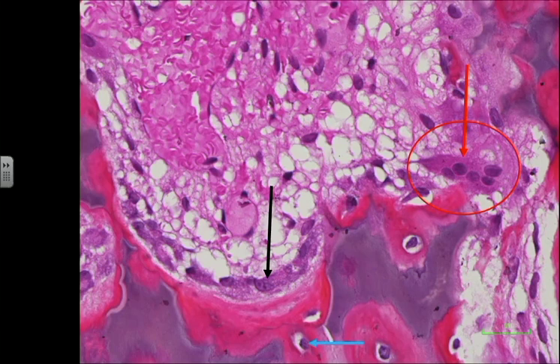What are the characteristics of osteoclasts? So, if we look at this image, let's identify the histology we have first. So first we have bone. This bone is in a child because I can see it's pink, but it still has the purple centers, which represent remnants of the cartilaginous skeleton, which started in the fetus and continued through infancy and as early as 5 years to become changed to bone.